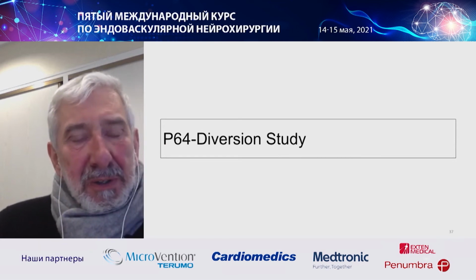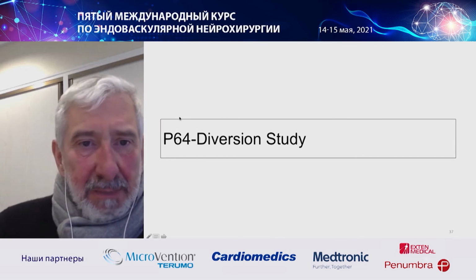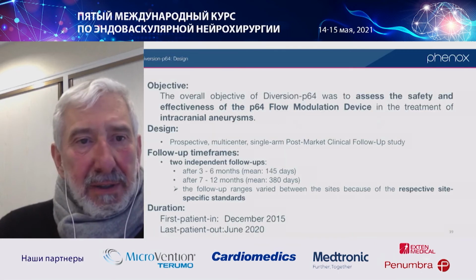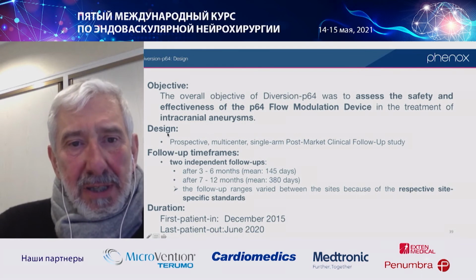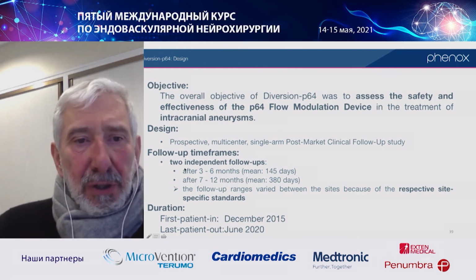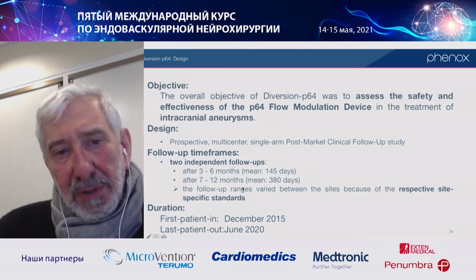So, you know that there was a large P64 diversion study, and to my best knowledge, some of you were participating in this study. The results publication is under preparation. The idea was to evaluate the P64, the first version, detachable version. There were 2 independent follow-ups, one at 3-6 months, one at 7-12 months.